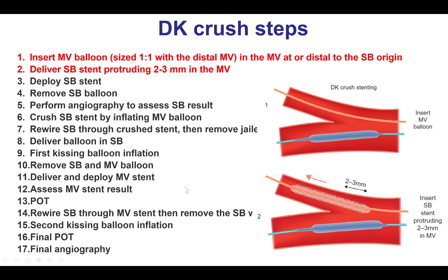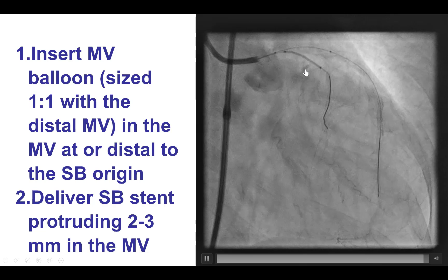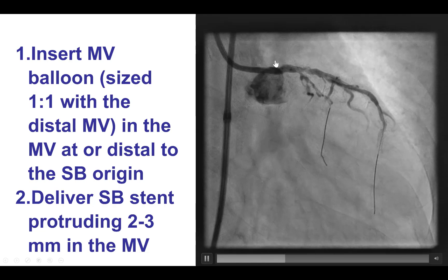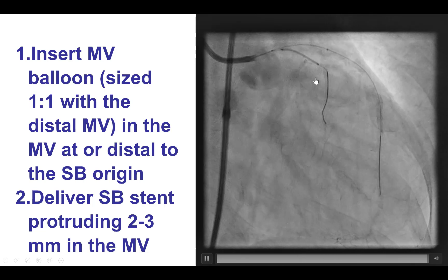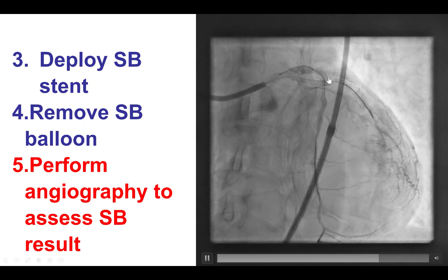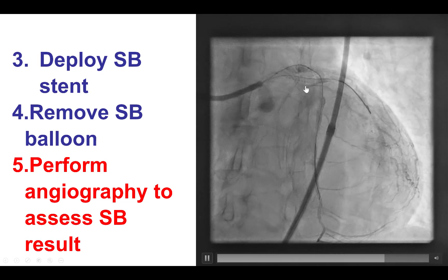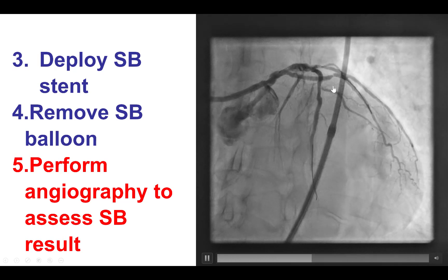The first step is to insert a balloon into the main vessel and then a stent into the side branch. The side branch is the circumflex, so here we have the stent into the circumflex protruding 2-3 mm into the left main. We have a balloon in position to perform the crush after the side branch stent is deployed. This was successfully done and the balloon of the stent was removed.